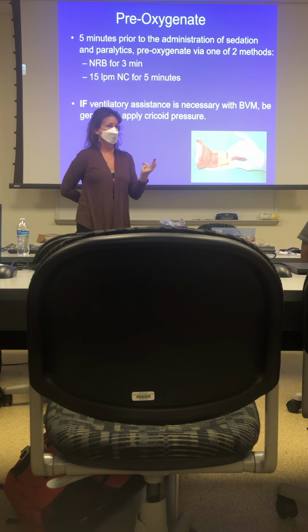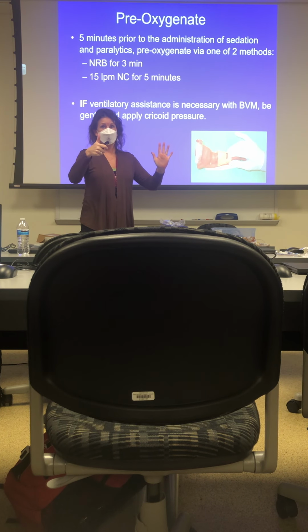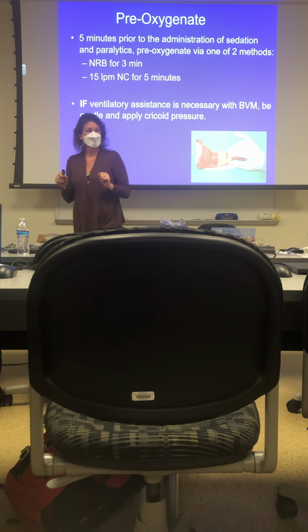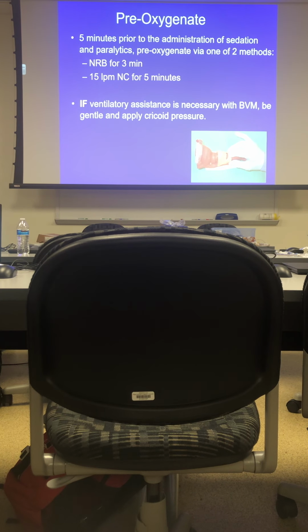Can I go to 2 liters? 3, 4, 5, 6. Can I go to 7? No, it's 6 liters, remember? 24, 28, 32, 36, 40, 44. It's like you have 44%. You guys have to review that before you go back to clinical. All right, they're going to ask you, and you need to know that.